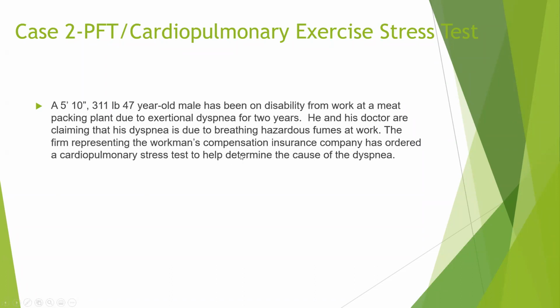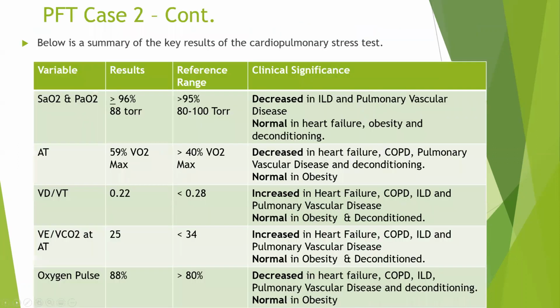Okay, so this guy is about my height. I weigh, as I said, 180 pounds, give or take, 185 pounds, and he's 300 and change. So we're going to put him on a treadmill or exercise bike. Probably, by the way, if this test is actually going to be done, he's not going to be on a treadmill. He's probably going to be on an exercise bike.